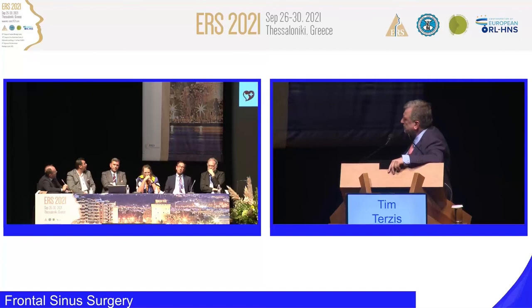And the other side looks not too bad, very wide anterior-posterior diameter, and maybe the problem is not up in the frontal. I'm not sure. There seems to be, I'm not sure if there's a tiny lamella very high up in the frontal. I'm not sure about this, but I think the blockage is in the ethmoid cavity. Maybe you go there. Maybe it's an incompletely resected concha bullosa, and you open this nicely, and then some secretion will come out. So this could be. Okay. Vlad?